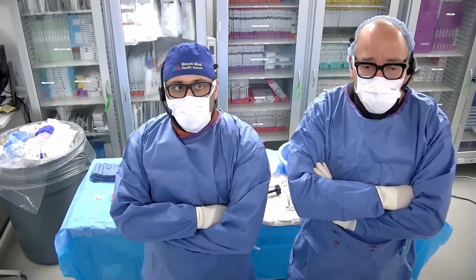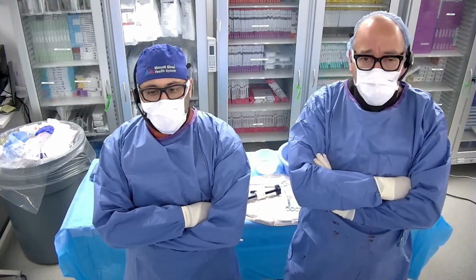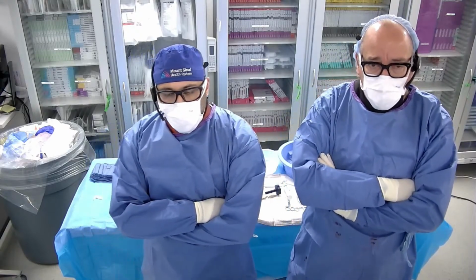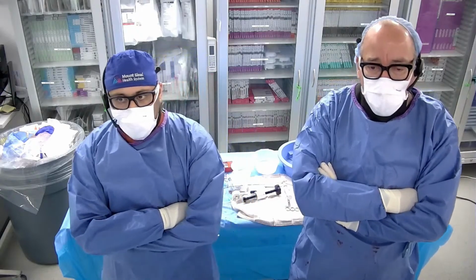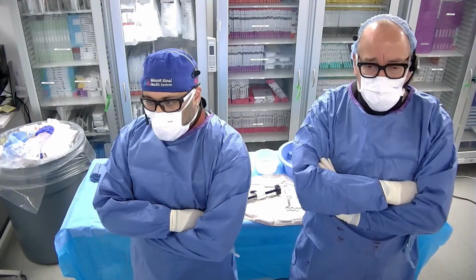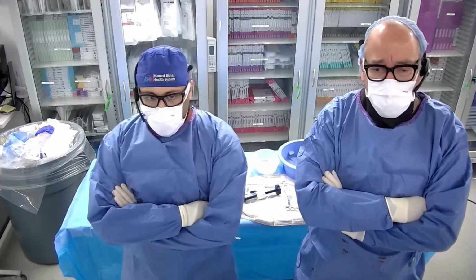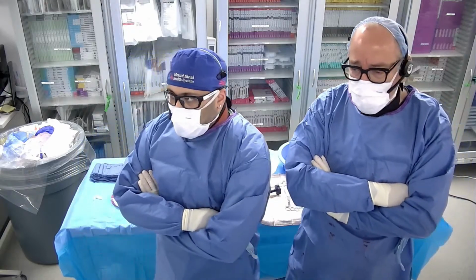We have a great case. We're doing it a little bit differently. This is something that sort of came up, and I thought it would be a good opportunity to try and evaluate what I would consider to be new technology. And so we have a really interesting case that we're going to share with you today, and hopefully we'll make it really educational and go through a lot of teaching points about it.